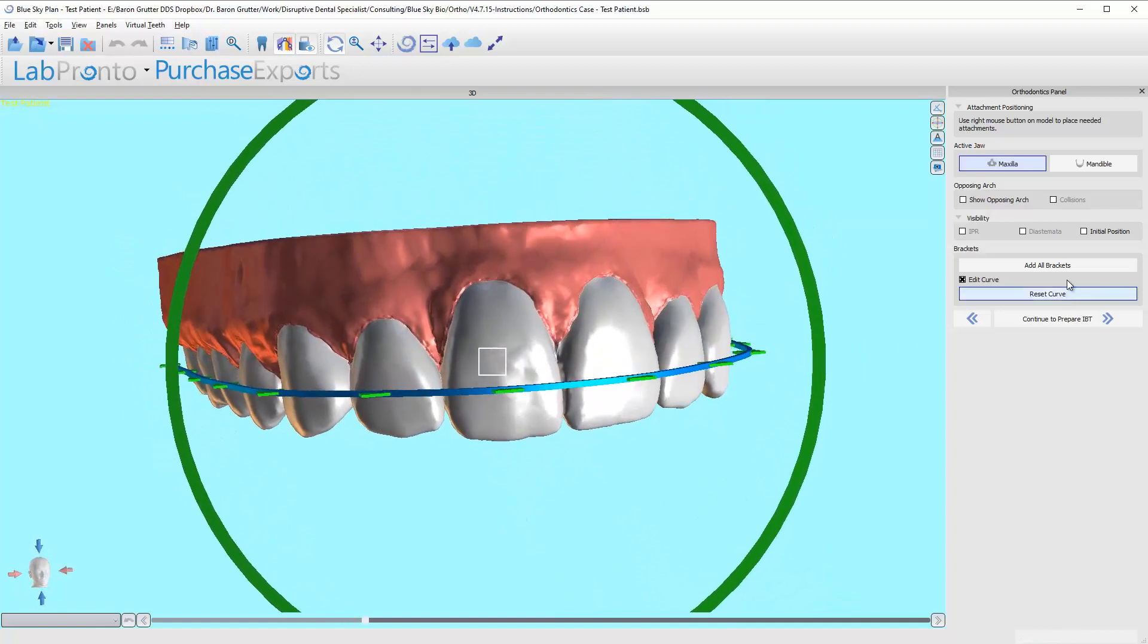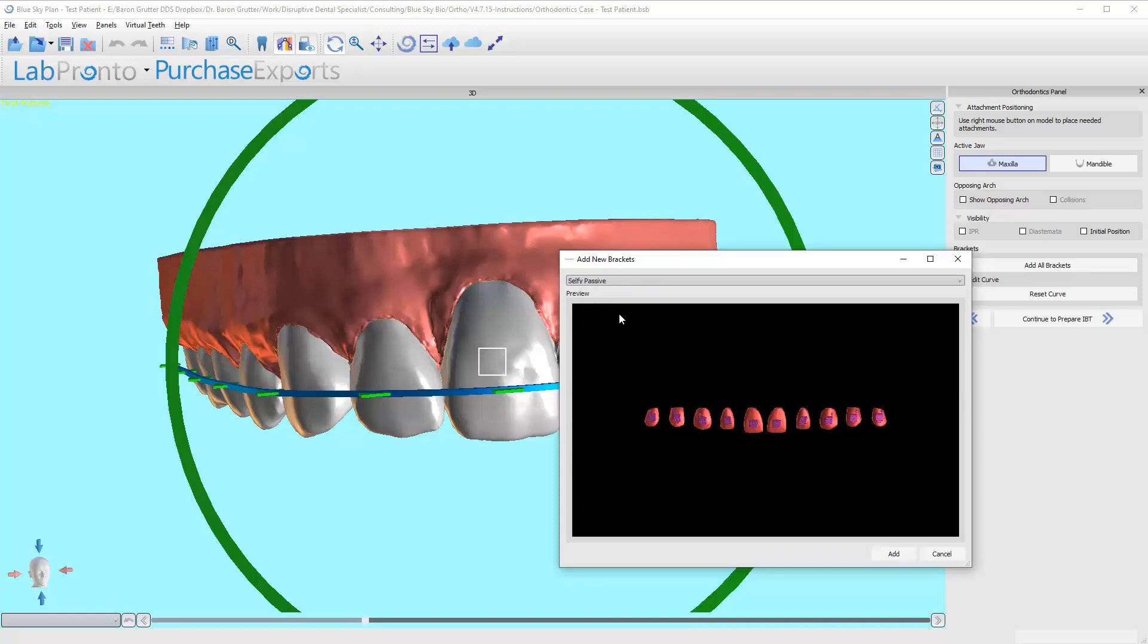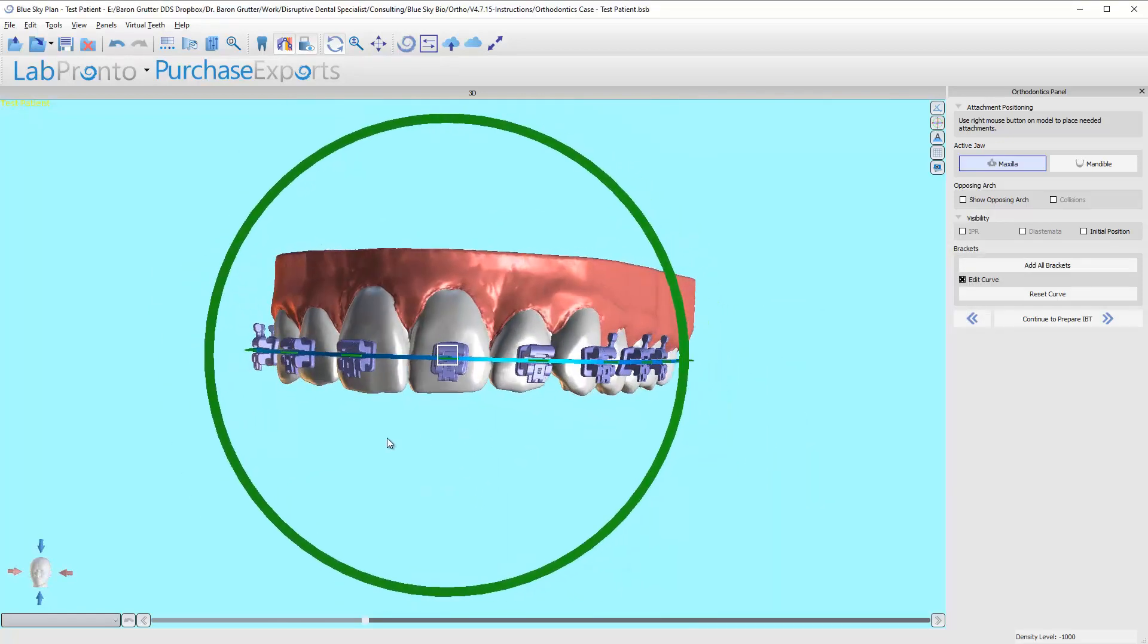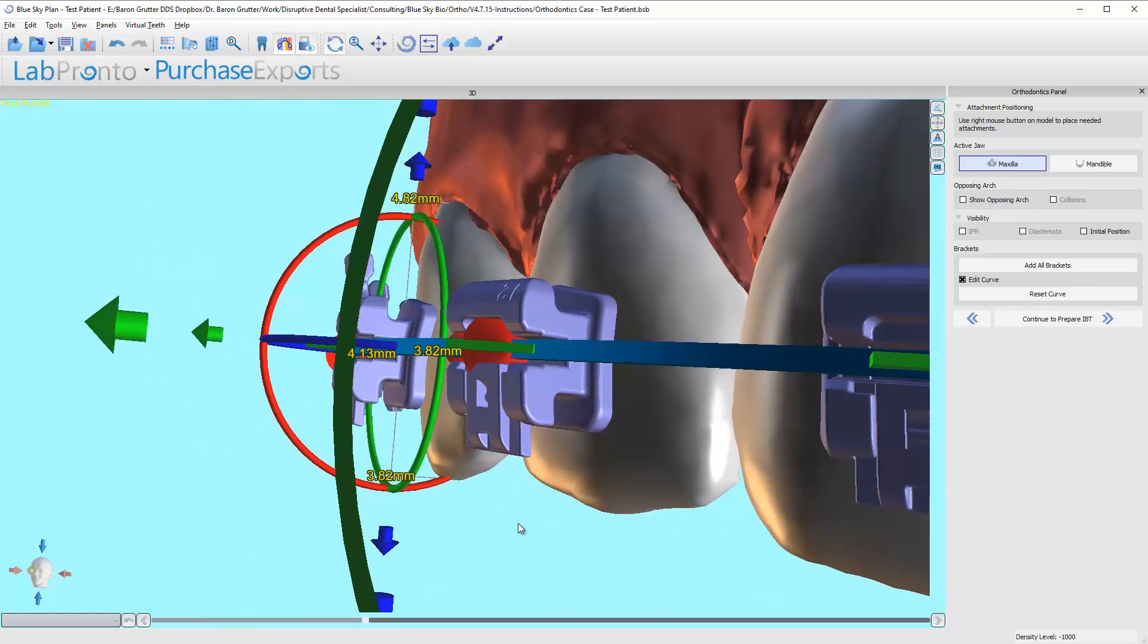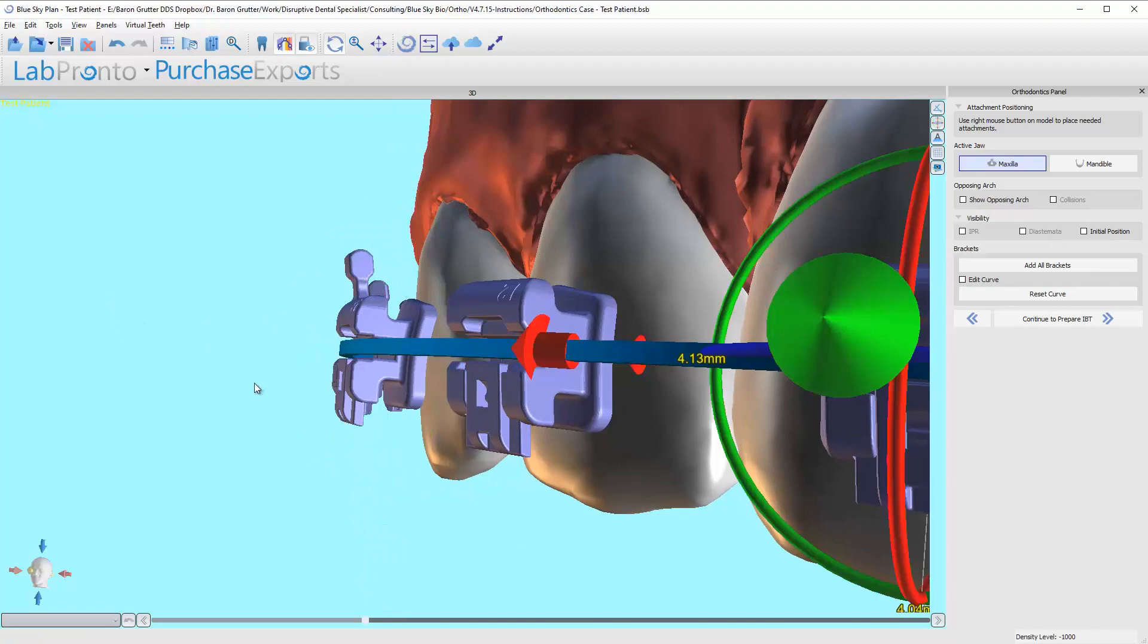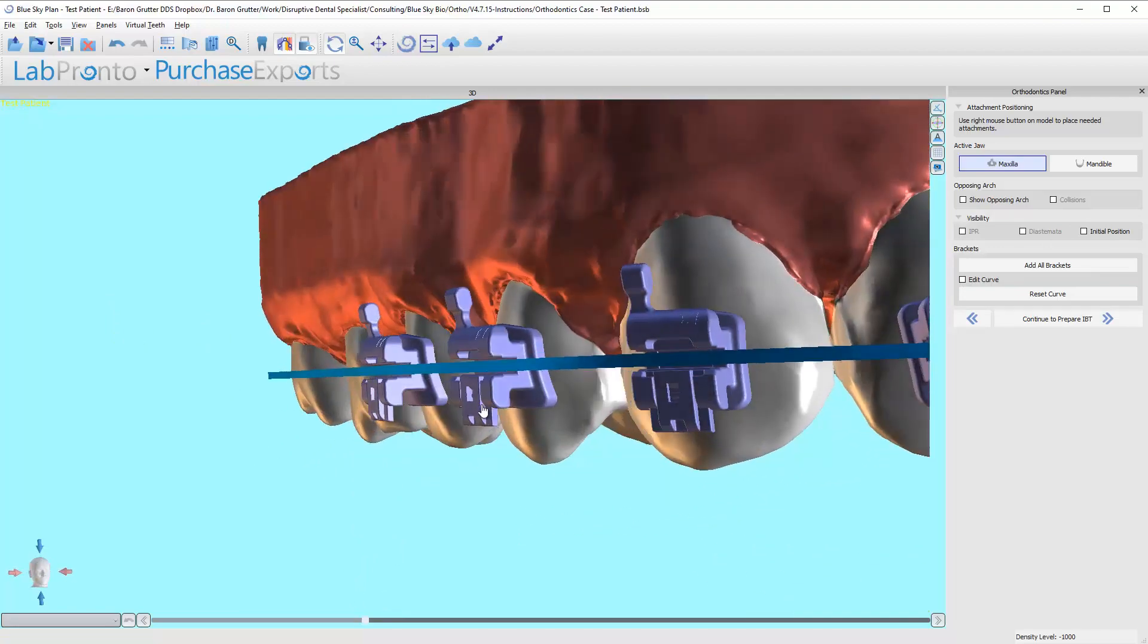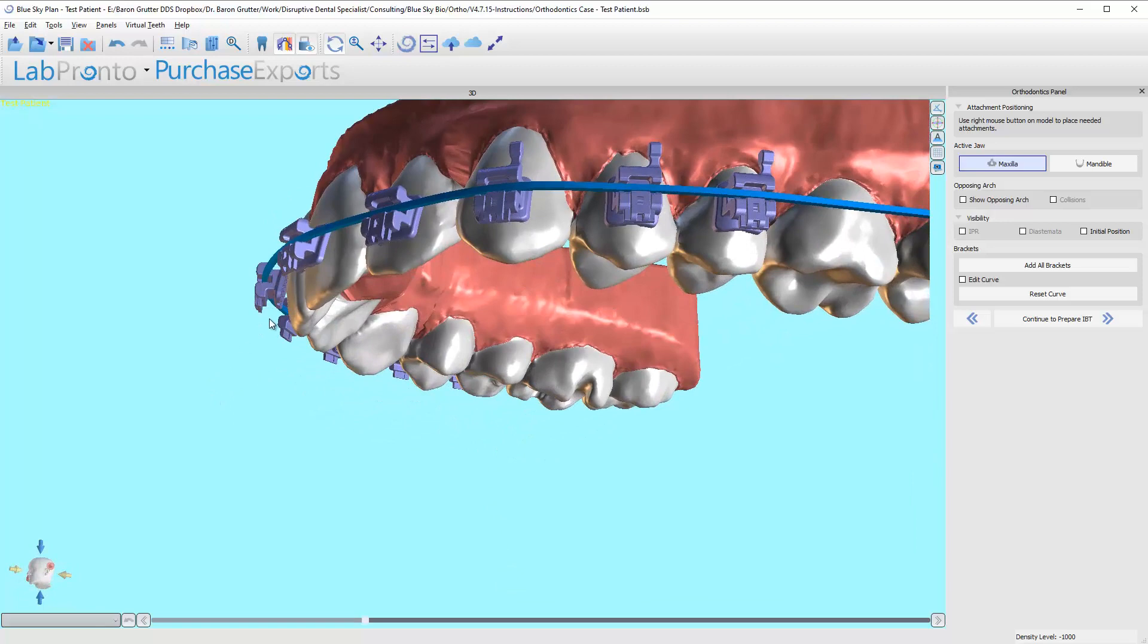So let me go ahead and say add all brackets. Once again, I'm going to click the self-ligating passive bracket line. And here are the brackets. All the bracket channels, if you look, let's turn off this curve, don't need to see that right now. They are lined up to the wire. They are not lined up to the teeth.